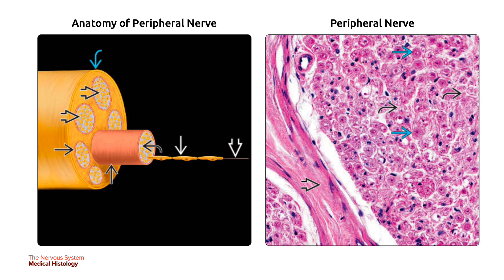On the right is a high-power view of a peripheral nerve cross-section showing individual fibers — the axons — in blue straight arrows in parallel arrays, surrounded by the endoneurium in curved black arrow and bundled into fascicles covered by perineurium in bold black arrow.